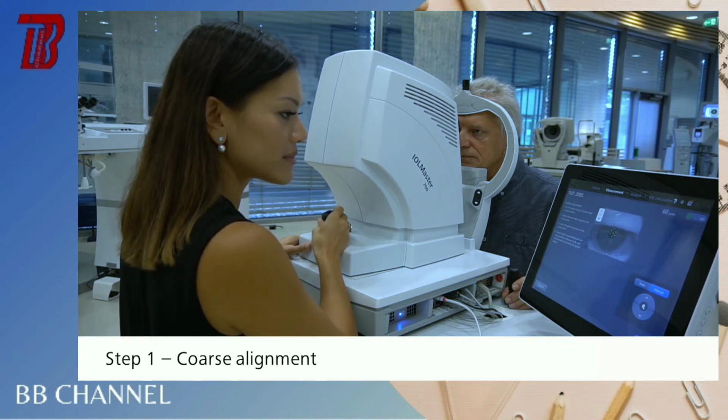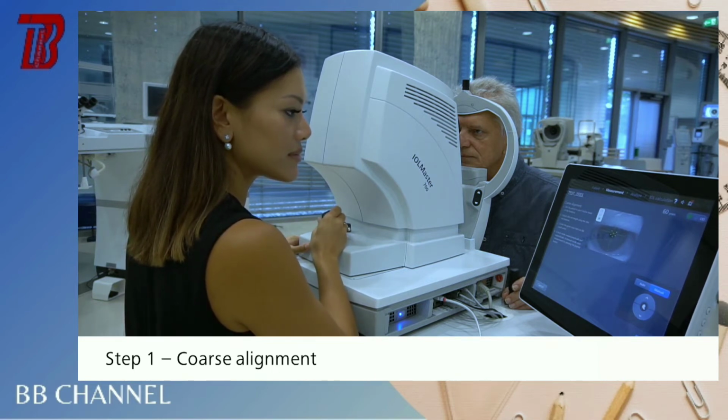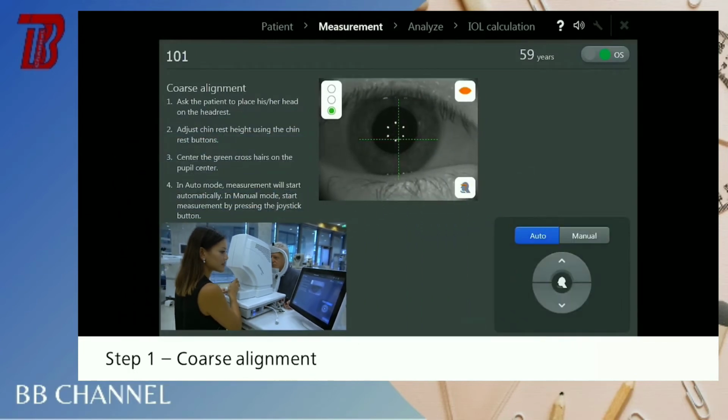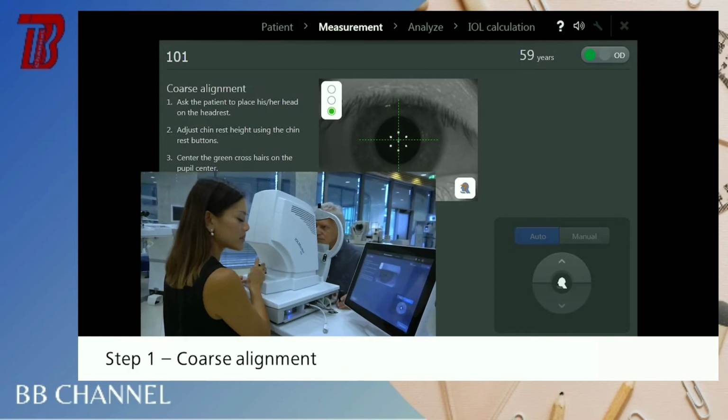Now your patient is ready for measurement. Ensure your patient is looking at the red fixation light and encourage blinking prior to measurement for a continuous tear film. Move the instrument to center the green crosshairs on the pupil center and ensure that the dots are in focus. You can use the traffic lights to find the optimal measurement position.